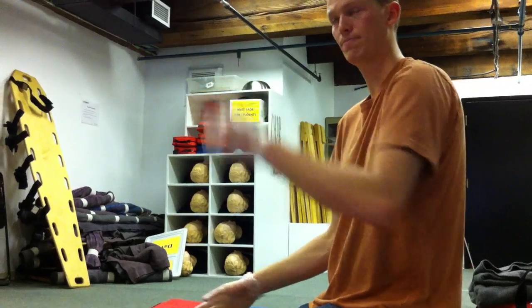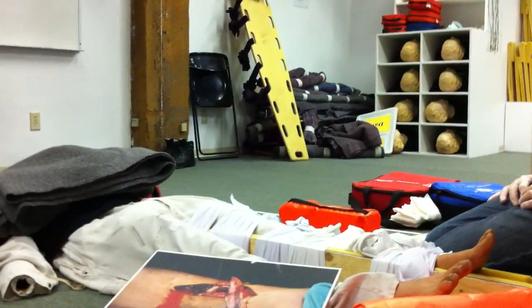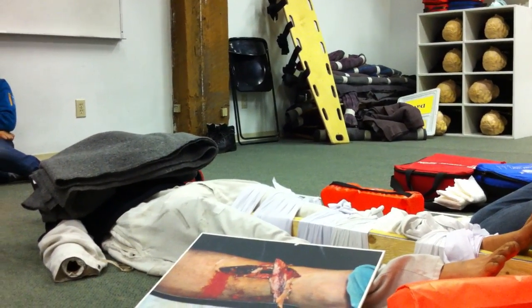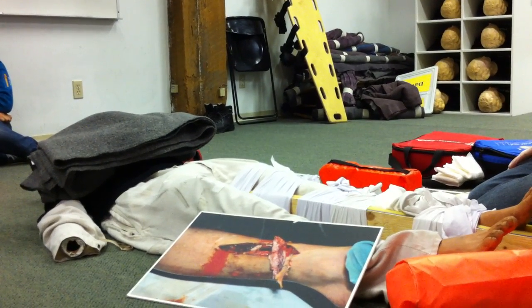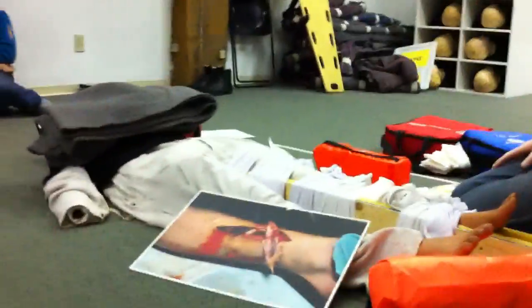Question? This flappy piece of bone on top, you're putting these triangulars and whatnot. Just gentle, just support. If that moves, it moves, and that's going to get moved.